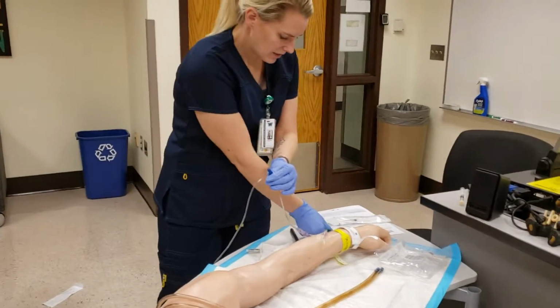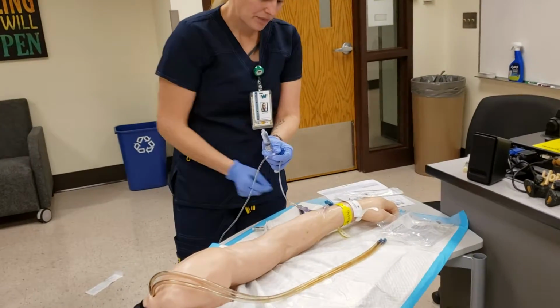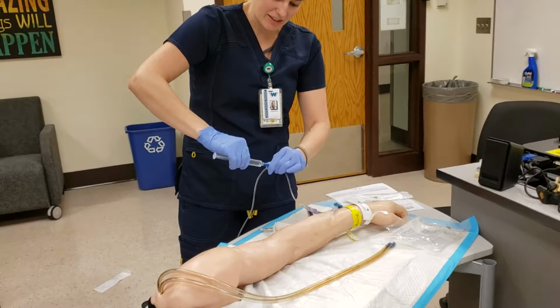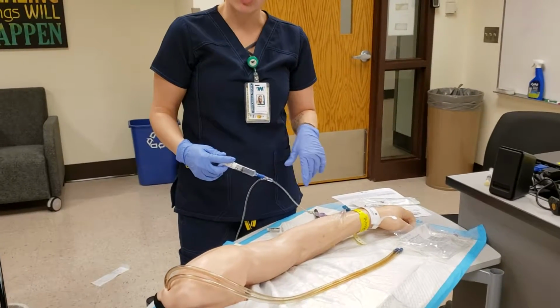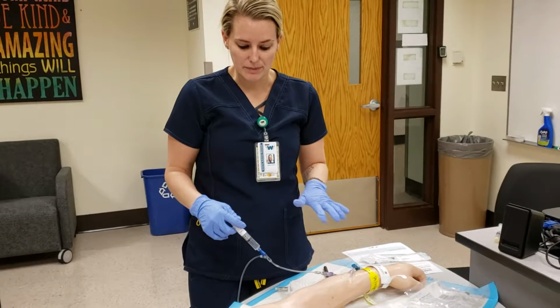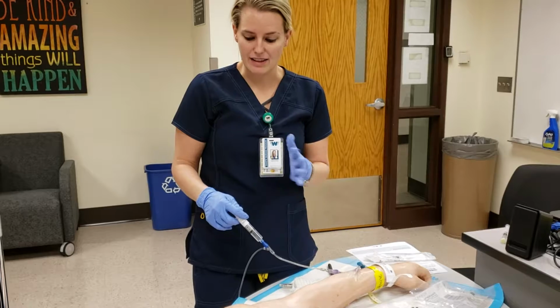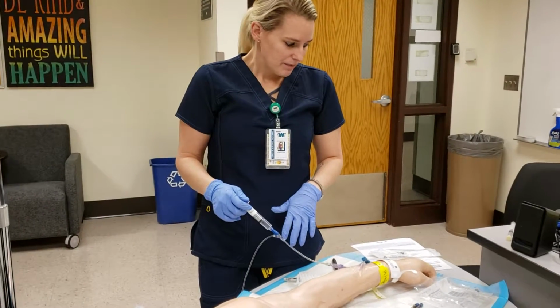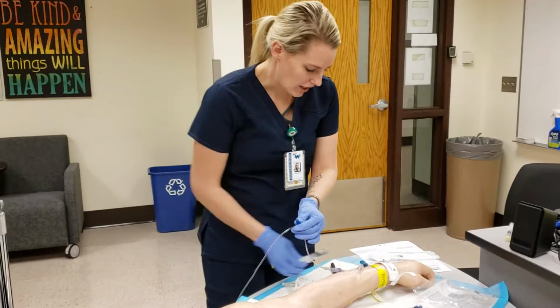And now I'm going to do my morphine, and I've done my calculations, and I need to push the morphine over 5 minutes. So as I'm pushing the medication, I'll go slowly. As I'm pushing, I will watch my client, observe for respiratory depression, and ask them how they're feeling, make sure it's going okay. So now that I have pushed this over 5 minutes, I'm gonna go ahead and flush.